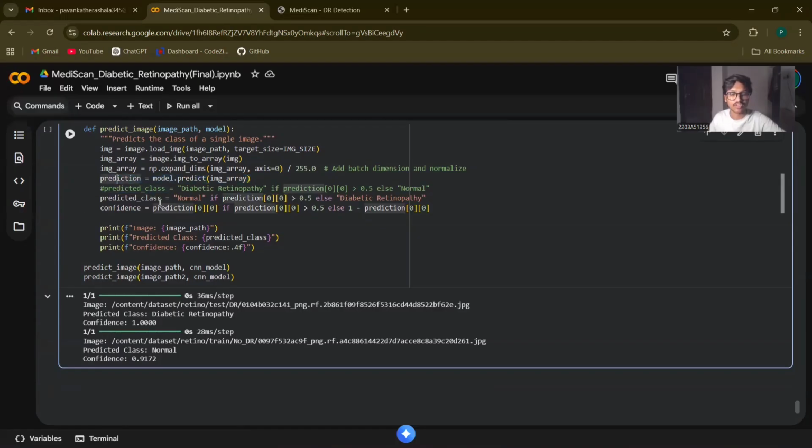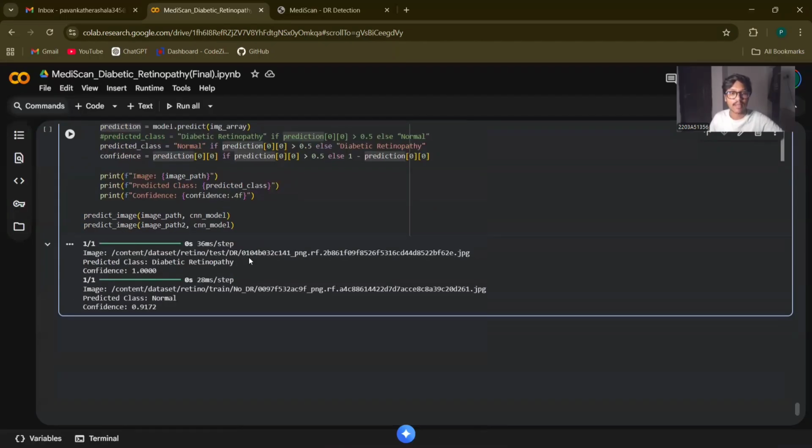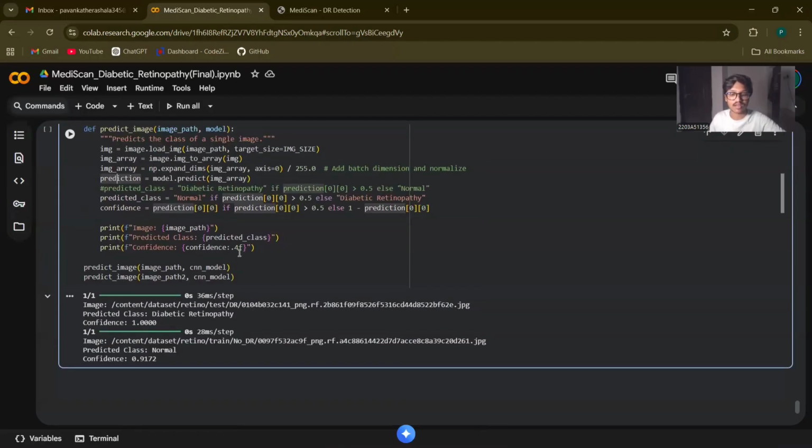So here, this line performs the model inference. The prepared image array is fed through all the layers of the CNN model, resulting in a single output value. The next one is the decision threshold. Since this is a binary classification, diabetic retinopathy versus normal, the model's output probability is compared against a threshold of 0.5. As this is binary, the output probability must be a number between 0 and 1.